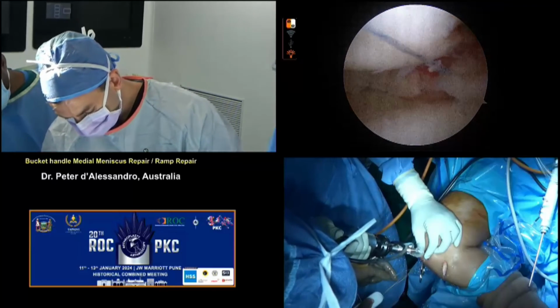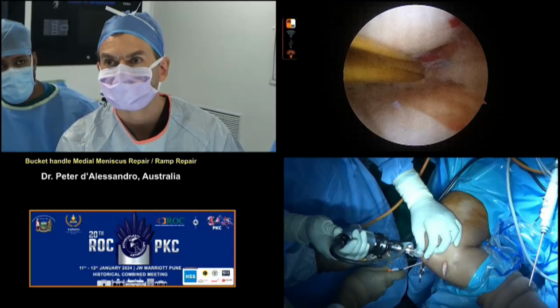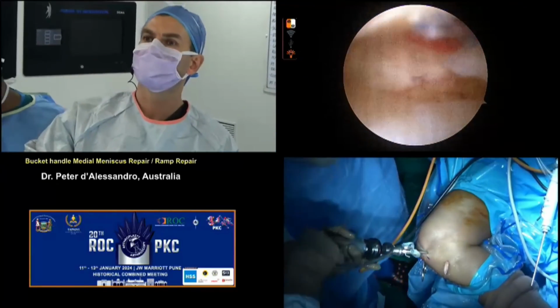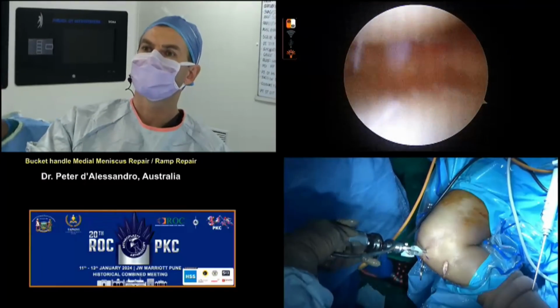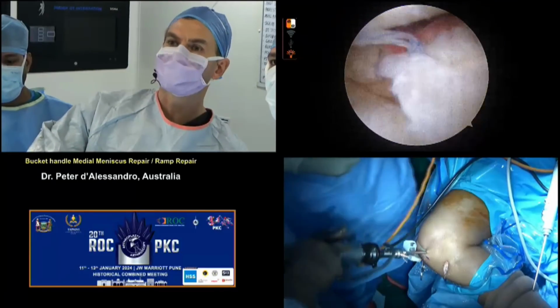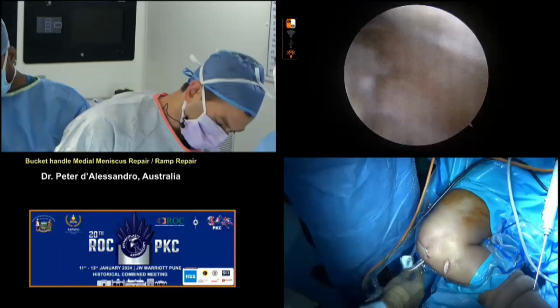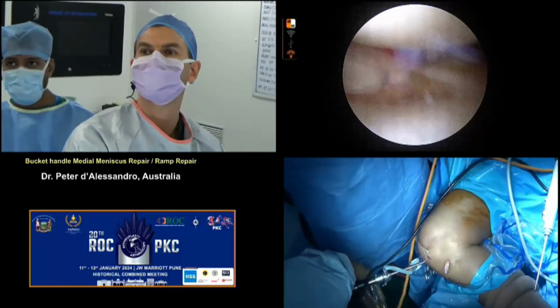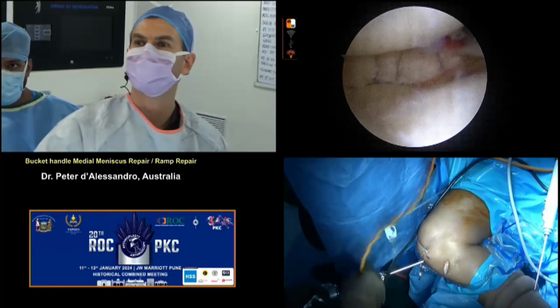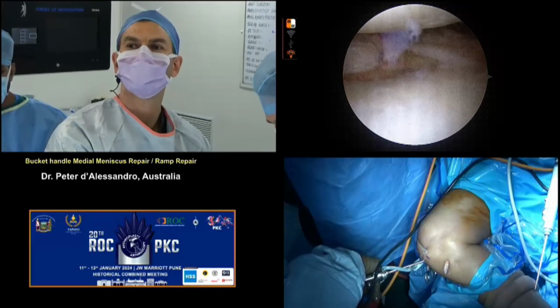So we'll cut that. Okay, we'll have a little look at that, little pump, thanks guys. Thank you, little pump of fluid for visualization there. So we're looking pretty good. Now who thinks I need another side to side here? What's the vote? I'm going to say you don't need it because it actually looks really nicely approximated.